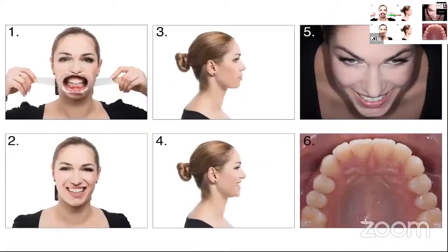Digital smile design, a lot of people have heard about it, but fewer people are using it. We are working with digital smile design in every case because it's not only to motivate the patient, but to analyze what we are doing. And you take shots of the face, but we also take a shot of the so-called 12 o'clock, which is number 5 in this screen.